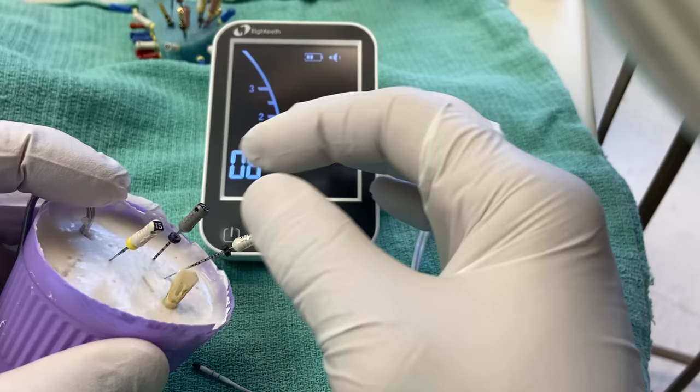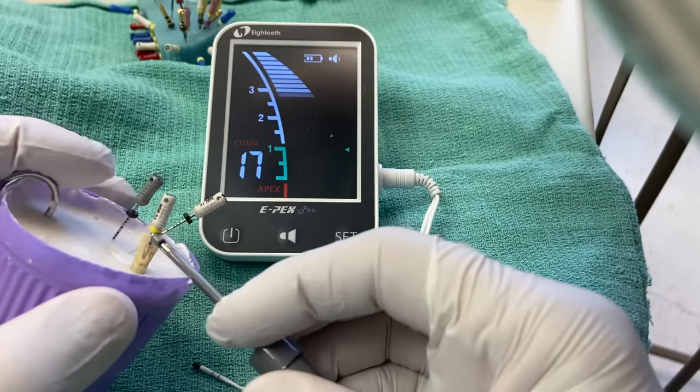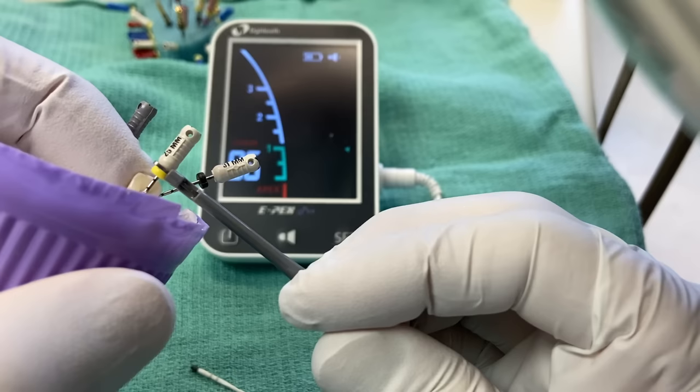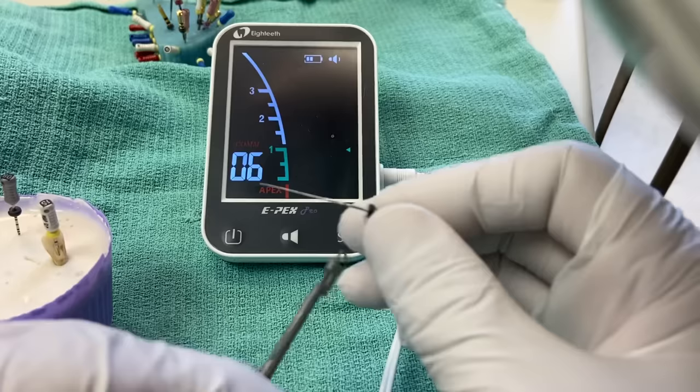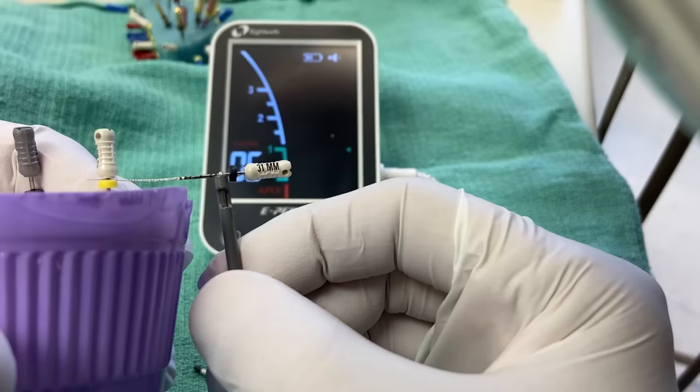Getting back to getting your working length: sometimes an 8 or 10 file isn't sufficient to elicit a solid, stable response from your apex locator. So what you do is increase your file size. I'll take my size 15 file, place it to length, and check for a working length. One tip I've shown before — you can take a file and use it like a little conductor to help guide things. Then you can wind your file down to length and still get your working length reading.